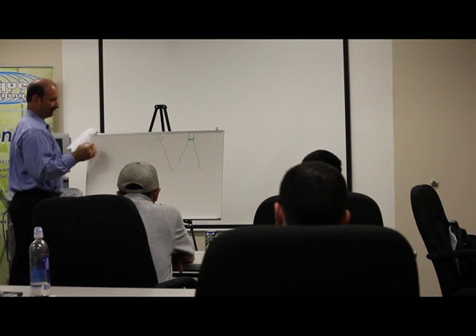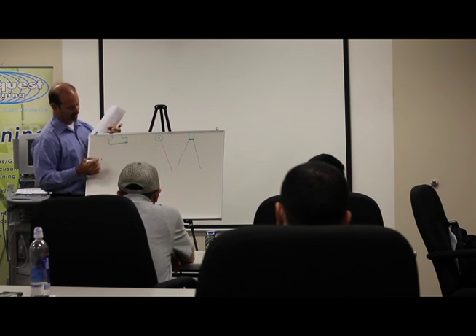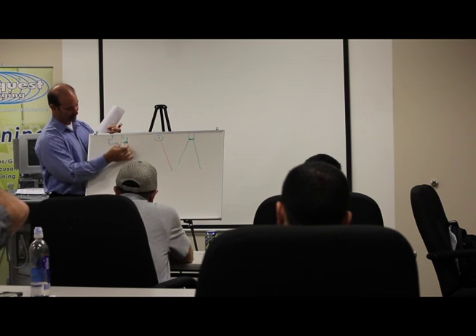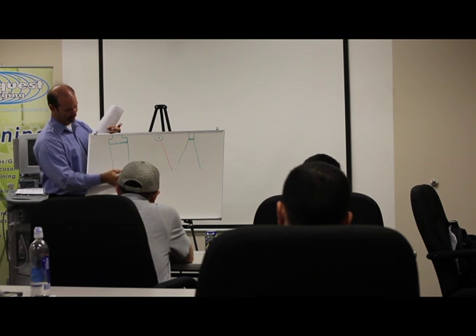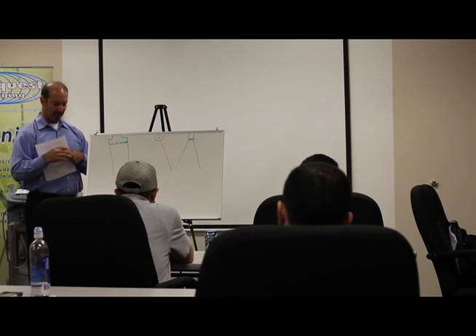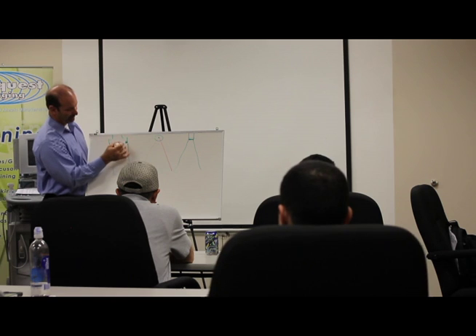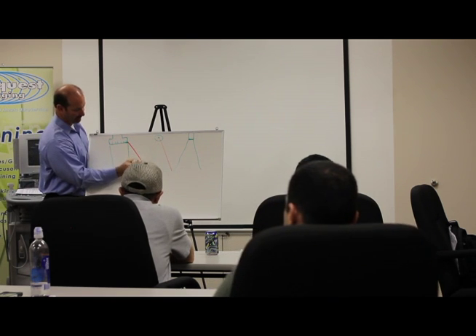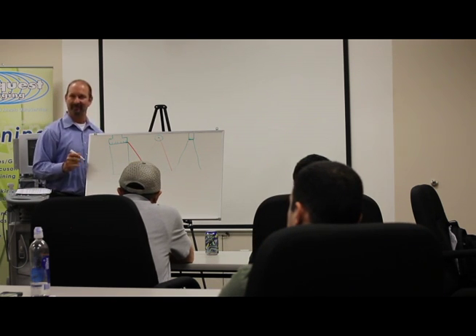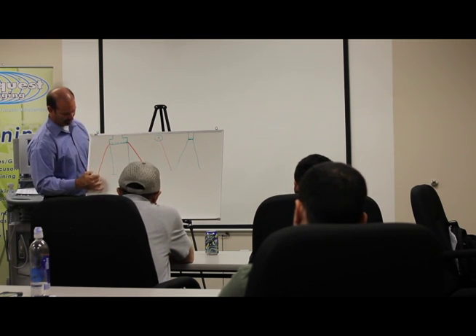A good example is GE's linear transducer. So here's your transducer. It's got all these crystals. Normally for a linear transducer, that's what our image looks like, right? On the Sequoia, we can plug in the 6L3. That's the image you have. Beam steering is what you'll hear today. This is what the image can look like. And then the new Sequoia 9L5 maybe, that transducer can create a trapezoid.